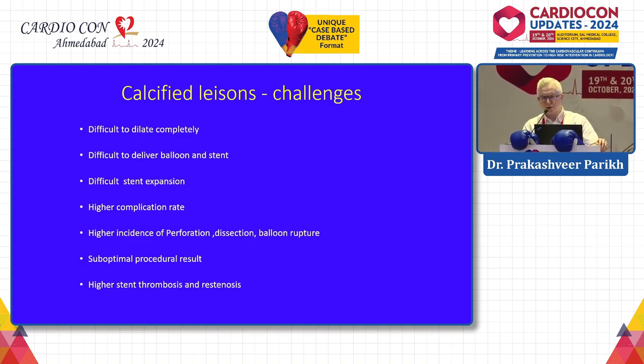There are several challenges. First, it's difficult to advance your balloon to dilate. Even if you are able to advance the balloon and cross the lesion, it's difficult to dilate it completely with the full opening of the balloon. Even if you can dilate with full opening of the balloon, it's always difficult to deliver the stent and expand the stent properly.